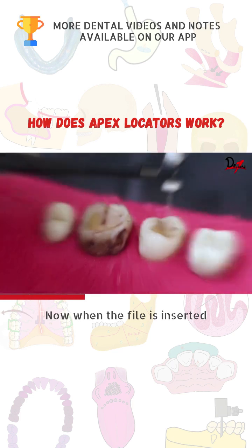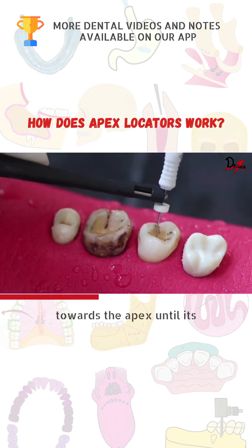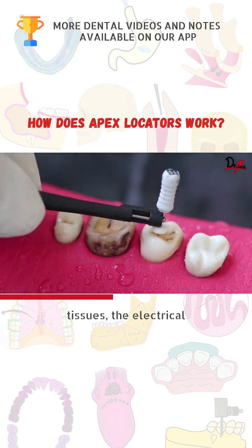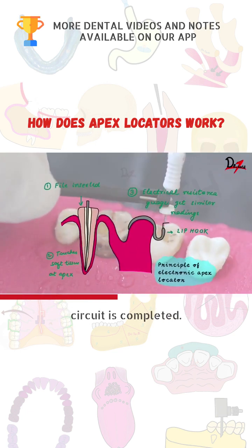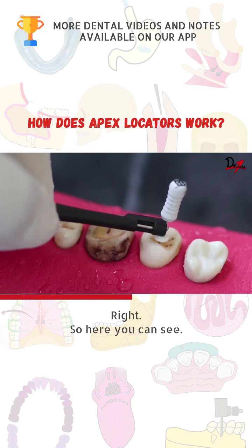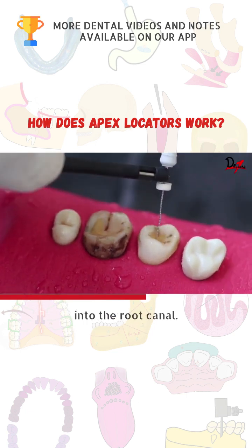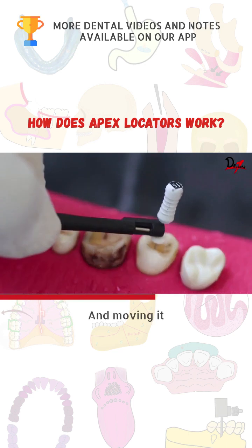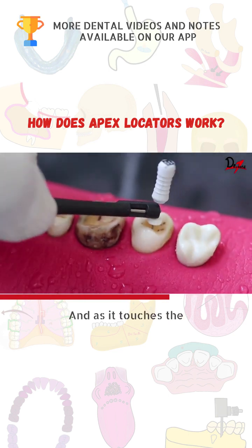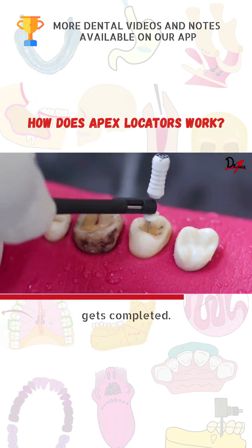Now, when the file is inserted into the root canal and moved towards the apex until its tip touches the periodontal tissues, the electrical circuit is completed. Here you can see I am inserting my file into the root canal and moving it towards the apex, and as it touches the periodontal tissues, the electrical circuit gets completed.